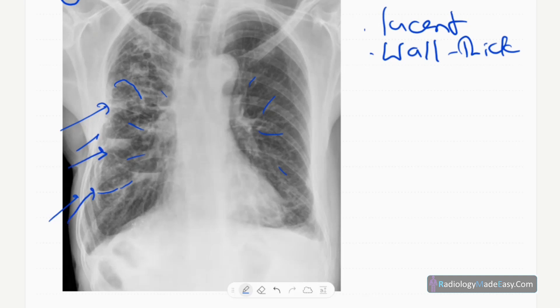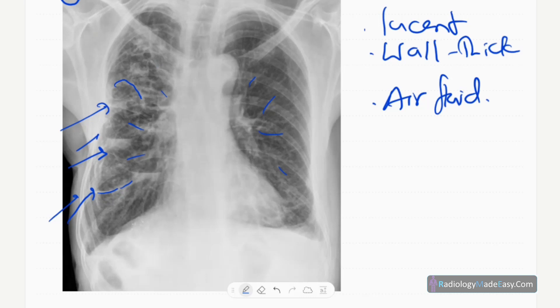Air-fluid levels are also present. The left side is relatively spared — the abnormalities are mainly on the right side. Some of them are linear or tubular lucencies. There are no hilar masses, the trachea is central, there is blunting of the costophrenic angles probably due to pleural thickening, no cardiomegaly, no mediastinal masses, no pneumothorax, and visualized bones are normal.